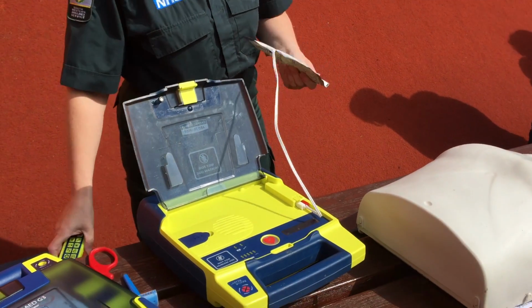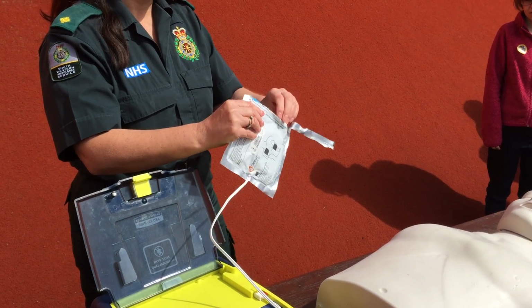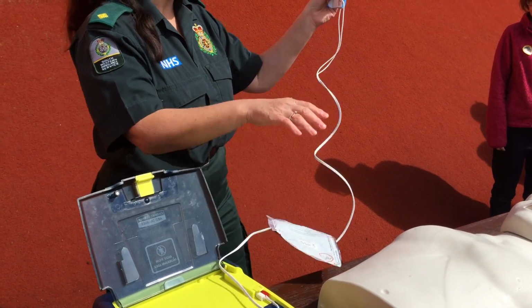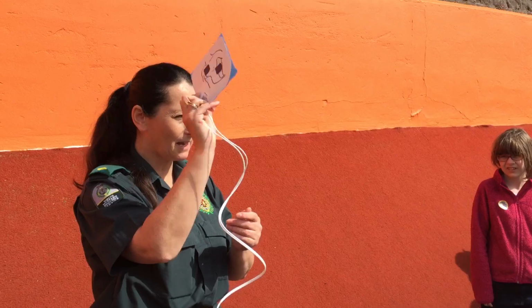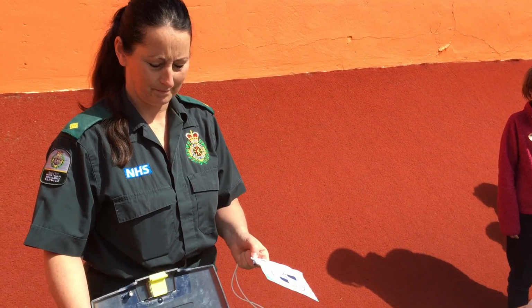Tear open the package and remove the pads. So tear open the package. Okay, so there's two pads. They are both exactly the same.